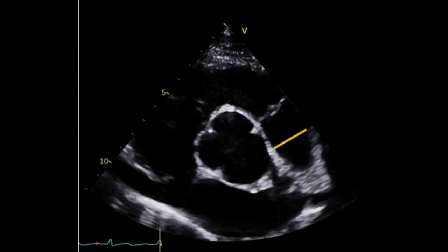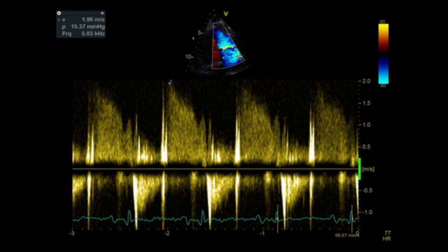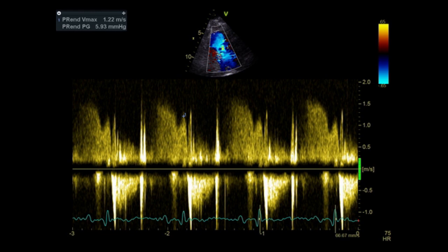After you have visually assessed the main pulmonary artery, you can measure the main pulmonary artery diameter if needed. Now continue with the forward flow assessment — using continuous wave Doppler across the pulmonary valve, measure the peak velocity and peak gradient. Now let's assess the regurgitation. With continuous wave Doppler you can measure the peak velocity of the pulmonary regurgitation and visually assess the regurgitant jet density and contour. At this level you can also measure the pulmonary regurgitation end-diastolic velocity.